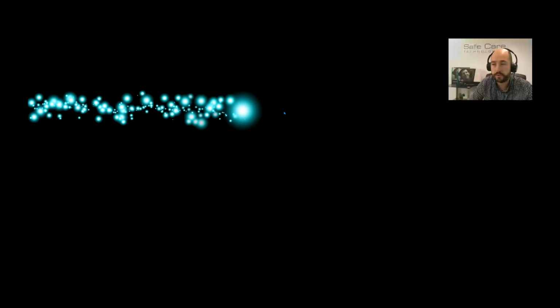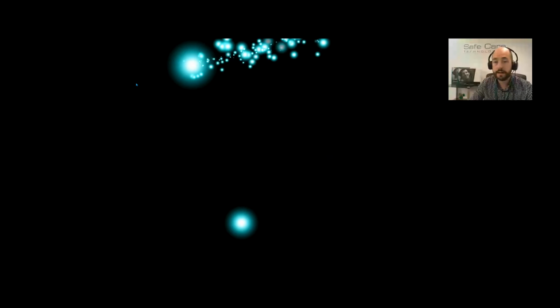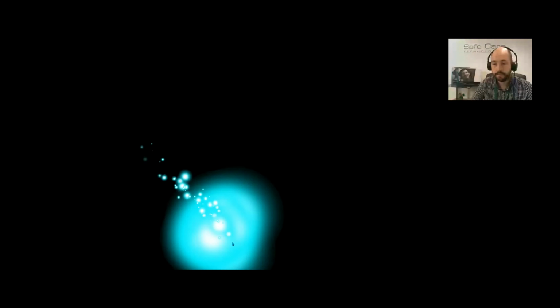Okay, so you'll see as I go across the screen here now, it's going to move for me. But all of a sudden, if I stopped looking at the screen, you'll see that this is what happens. Basically, it goes back to a blank screen. But if I am the instructor and I'm trying to get the user to actually engage with the device or the screen itself, what I can do is press S on the keyboard. If I press S on the keyboard, you'll see we'll have this dot. So that's just creating that engagement. It's getting them to look at that dot. So if I start looking now, and you'll see I'm looking around the screen, I can look towards this dot, and it selects that dot, and it gives that more engagement for me then.